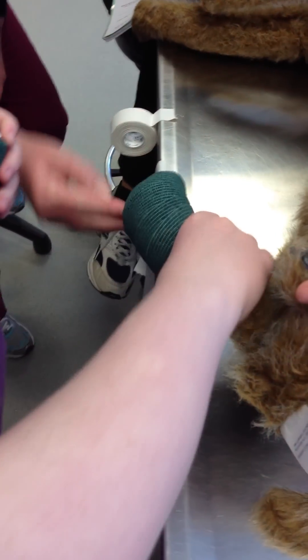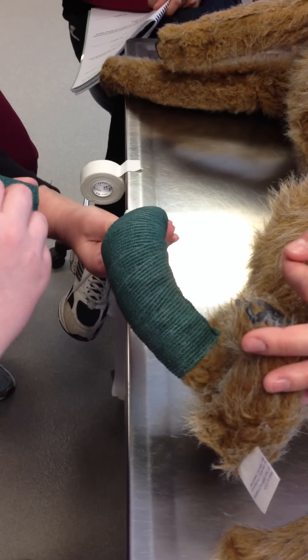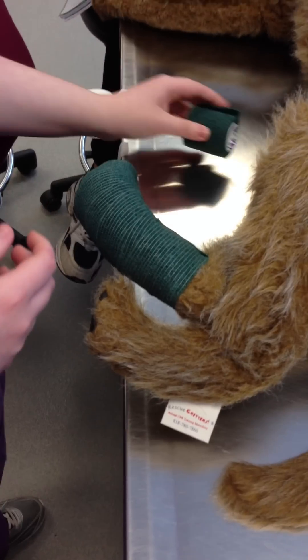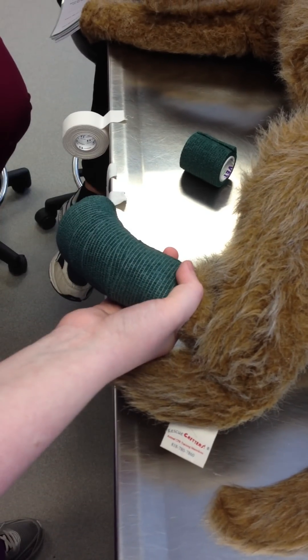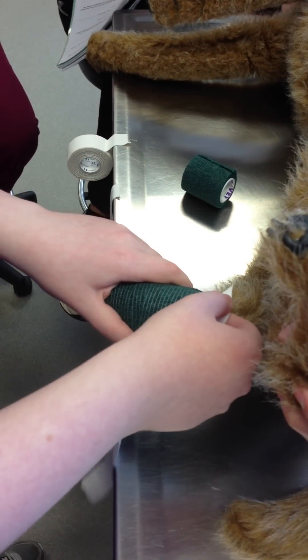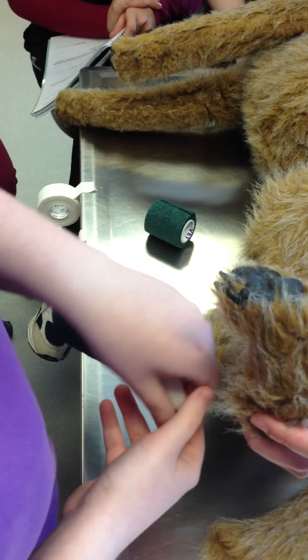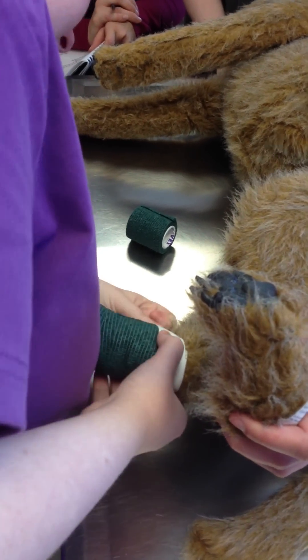It's really difficult not to have any little folds — I've got a couple of folds here too. You just take it and tuck it. It's going to be pretty hard to tape that toe; there's really nothing to stick it to, so I wouldn't put a piece of tape on that one — just leave it. But you do have to put a piece of tape at the proximal end for sure. In a long-haired dog, you can weave some of the long hair in between the two layers of white tape as you go around the second time — that really helps to keep it stuck on.